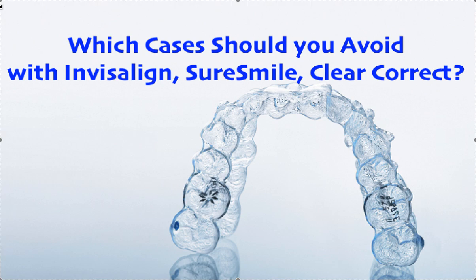Yes, there are workarounds, okay? And just because the Clincheck says it can be done doesn't mean it can be done, doesn't mean it will happen, doesn't mean it's predictable, doesn't mean it won't relapse, okay? These are so much more complicated than you know, and there's always an underlying etiology. You have to solve the underlying etiology.